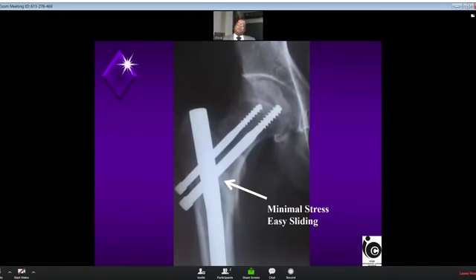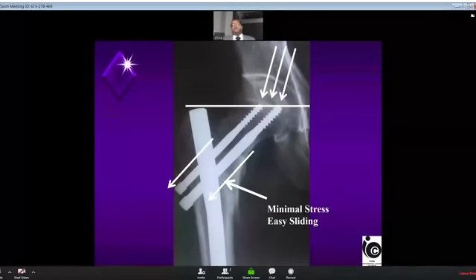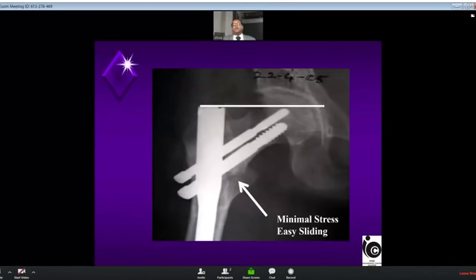Again, explaining the same. Inferior screw is longer and the superior screw is shorter, both of them take the load simultaneously and both of them uniformly collapse at the fracture site and both of them come out uniformly. If the inferior screw is shorter and the superior screw is longer, what happens?